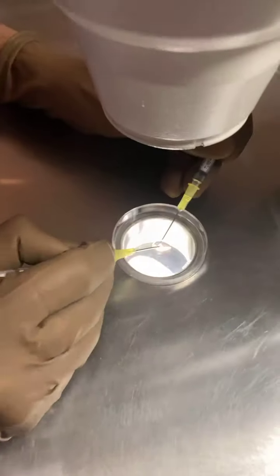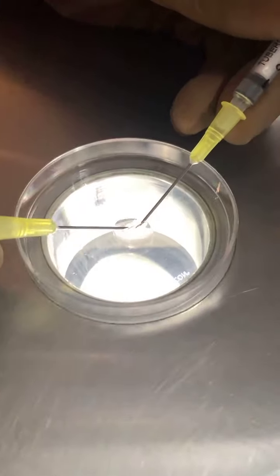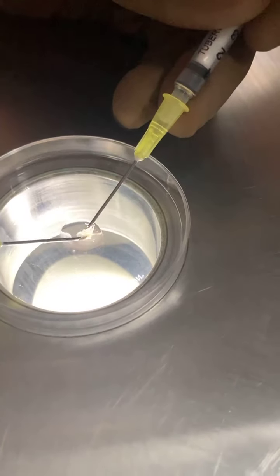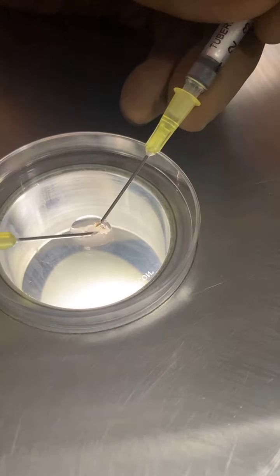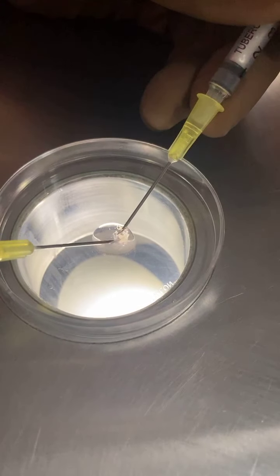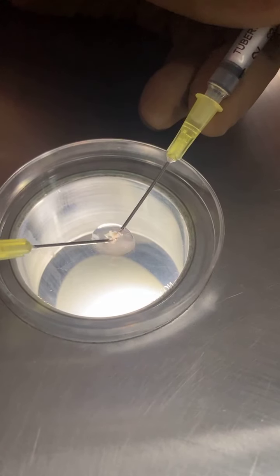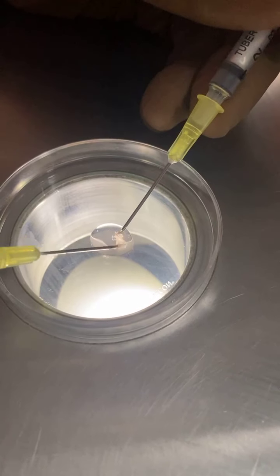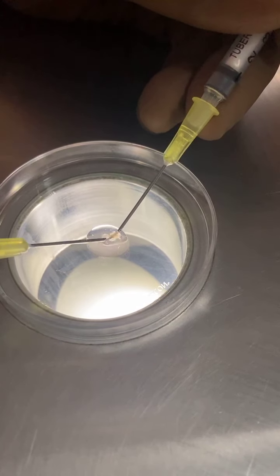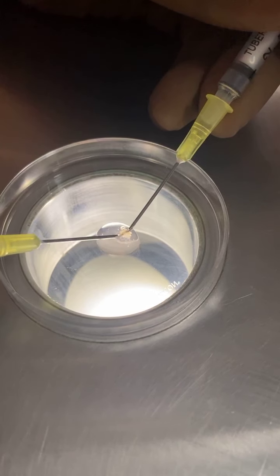I'll show you the hand movements first and then I'll show you how it looks inside the microscope. See the hand movements — I'm holding one part of the tubule and I'm trying to break it up. I highly encourage all people to do this, especially practicing IVF consultants, even if you are a busy IVF clinic. In my initial practice, I learned all these techniques on my own — how to do the dissection, how to mash up the tubules.